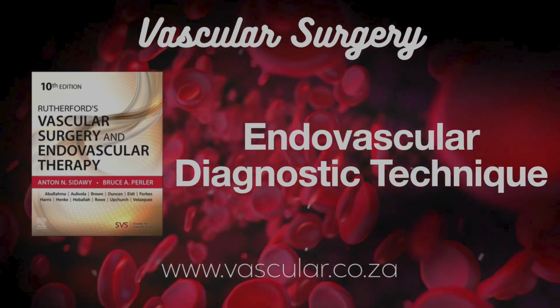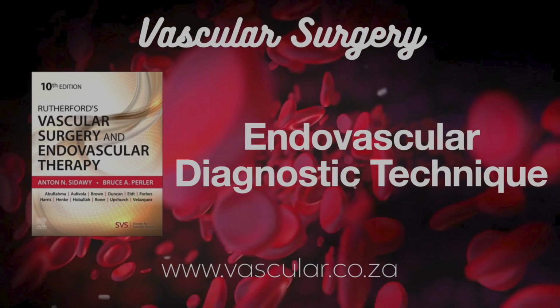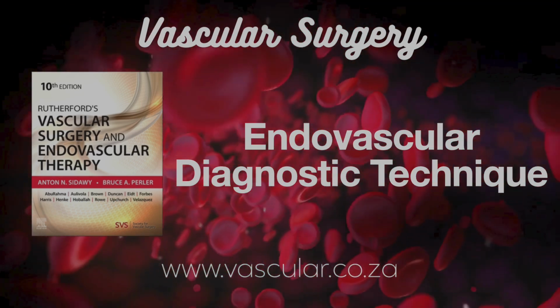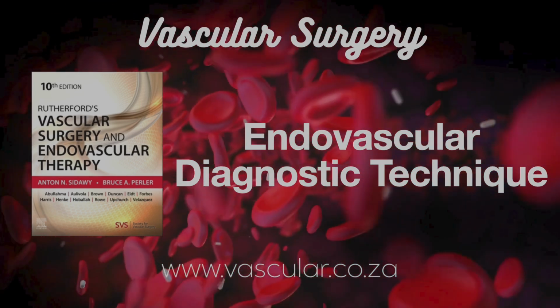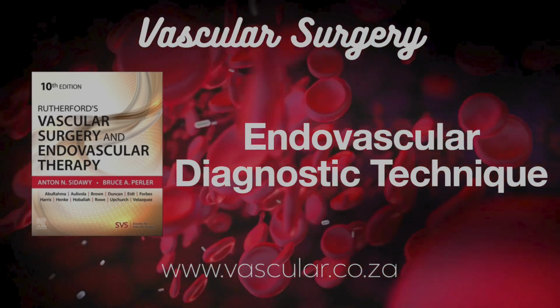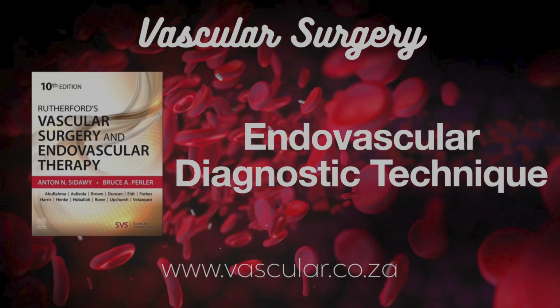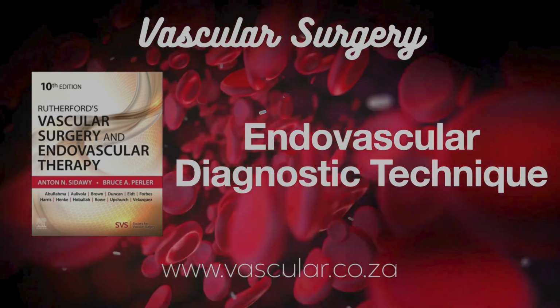Okay, procedure done. Need to close the hole. Closure devices are common now. Increasingly so. Designed to speed up hemostasis, get bleeding stopped faster than just holding manual pressure, can free up the room quicker. Does it save time overall? Bed rest time? Oh, that's the debate. While it reduces compression time, most patients still need several hours of bed rest afterwards. So the overall cost effectiveness is complex.